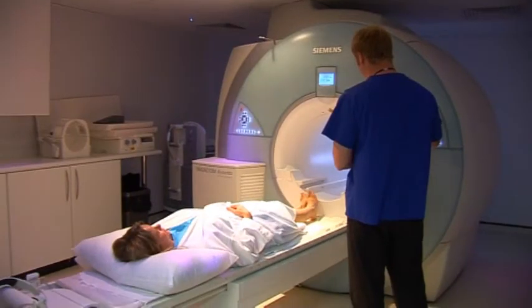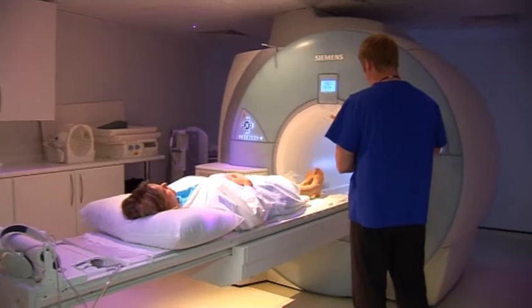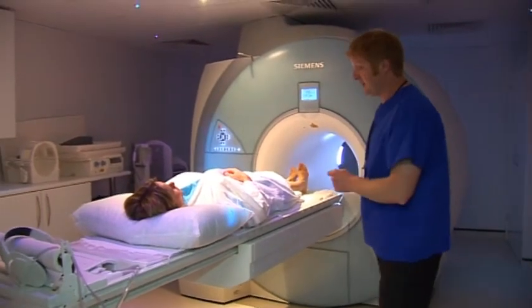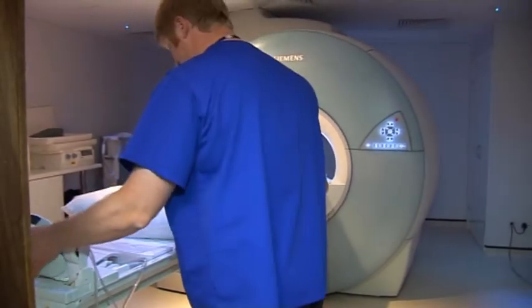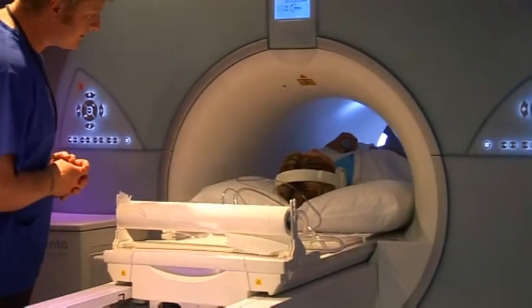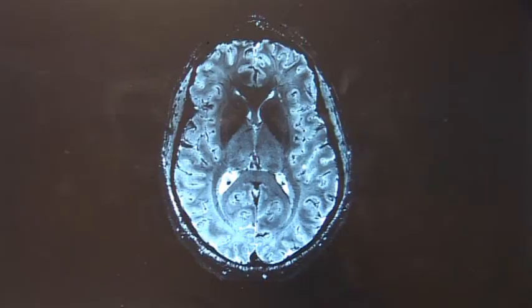An MRI scan is a magnetic environment where the magnetic field enables us to generate a small radio signal from the molecules in the body. And because this signal is very small, it takes a long time to build up a picture.